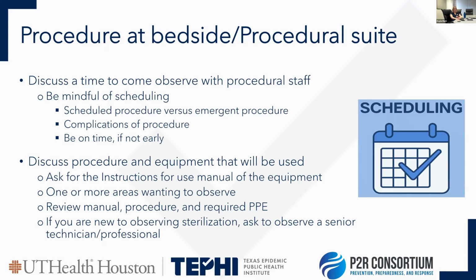You always want to make sure that you talk to OR or where this procedure, where the sterilized equipment is going to be used, making sure that they feel comfortable about it, that they know it. It's not an emergent case that it's being done. And then also that the whole area of SPD, the decontam, the clean packing, sterilization, and the sterile storage of the equipment area knows where you are.